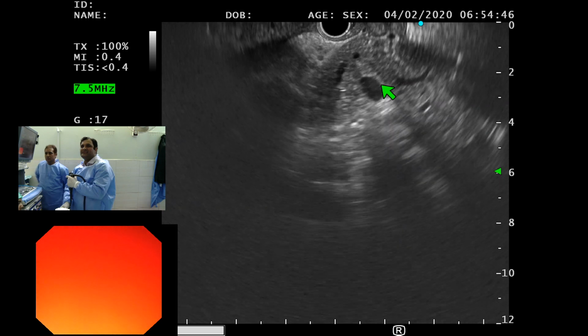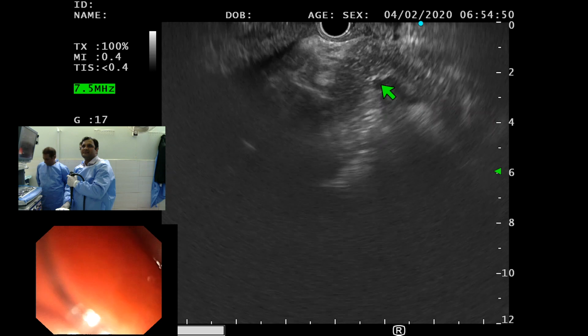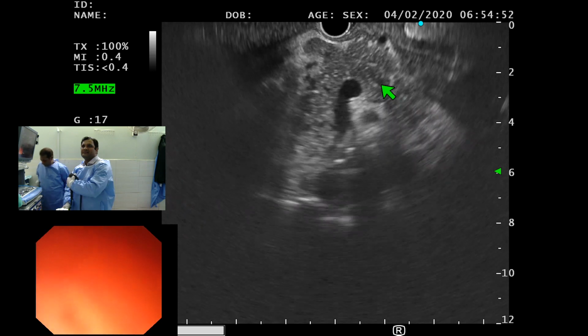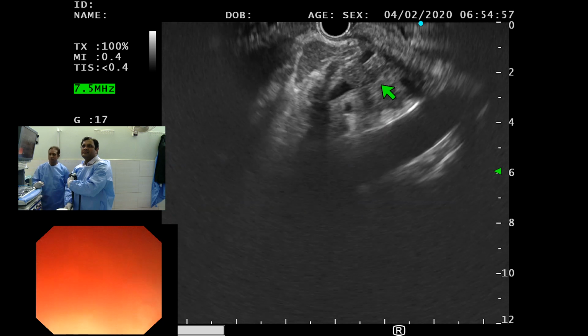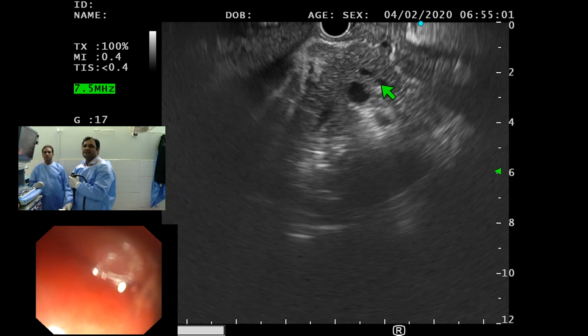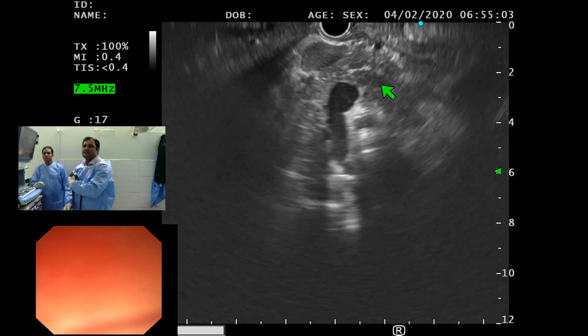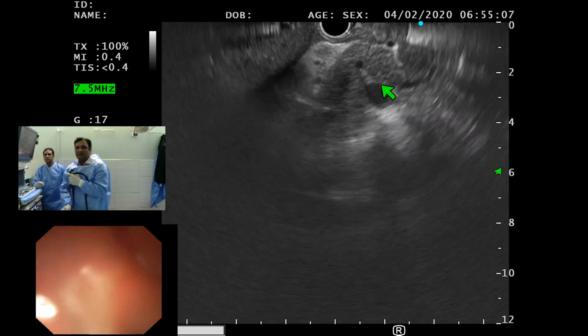So just as Khalid says, this patient has not learned the book. Because of the deformity, we are not able to go in just as it's written in the book. We are trying to have a look at the pancreas from an angle. This is not the classical anatomy that we expect in the D1.